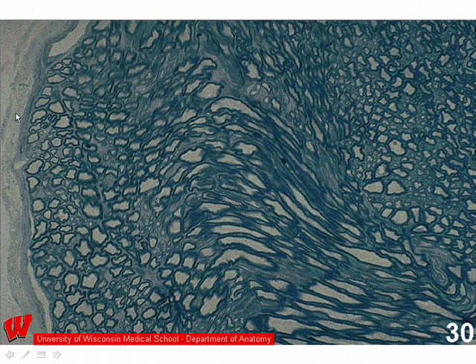Now note on the outside, there's an area that's pale stained. This is called the epineurium. And then there is an area which is more darkly stained and is cellular, which we'll look at a little bit more carefully under the electron micrograph. This is called the perineurium. And all of this pale blue substance in between the myelinated axons is endoneurium, or loose connective tissue.